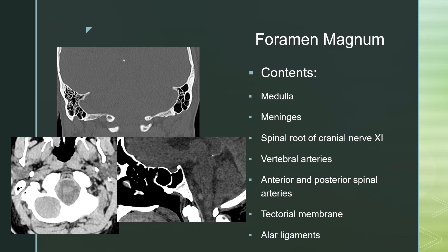Foramen magnum is a large defect within the occipital bone. It transmits the medulla, the meninges, the spinal root of cranial nerve 11, both vertebral arteries, the anterior and posterior spinal arteries, the tectorial membrane, and the alar ligaments. It's easiest to find because it's the biggest hole in the skull base. Here it is on the axials, and here it is on the sagittals.